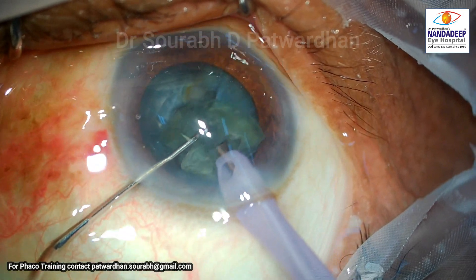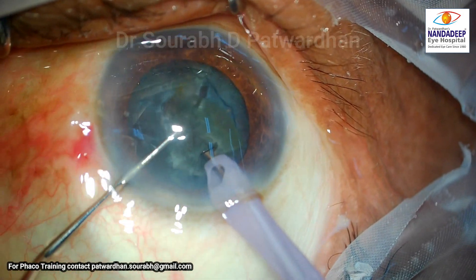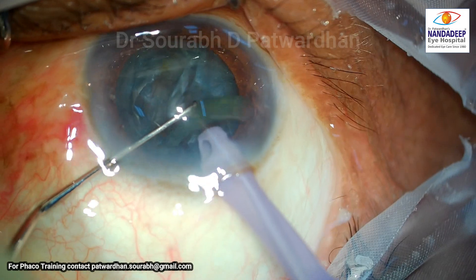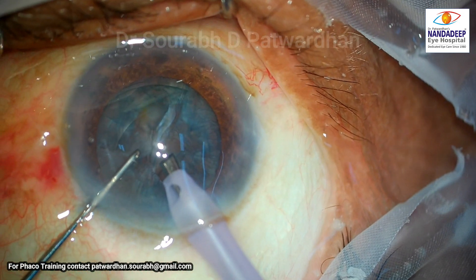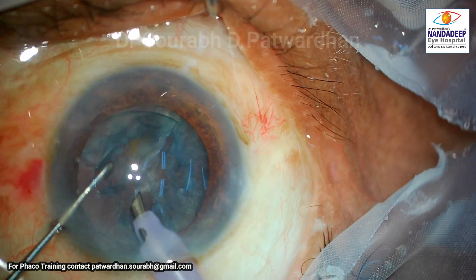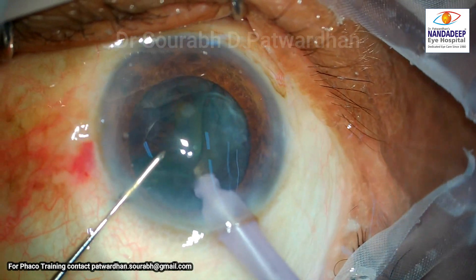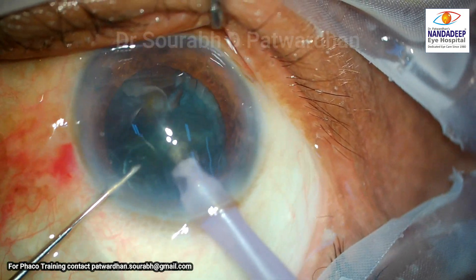There may be wound site edema here, and this is also not good for the posterior capsule, as irrigation may be compromised due to the withdrawal of the phaco probe — there is a high risk of posterior capsule rupture. The surgeon is trying to stay very anterior, but as mentioned, because of the position of the side incision, the surgeon cannot control the away movement of the globe.